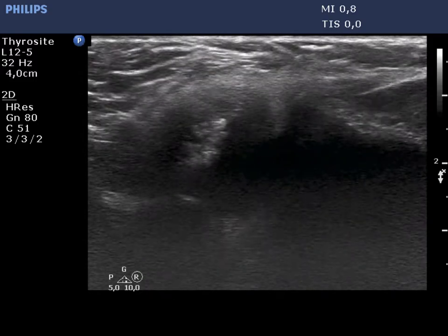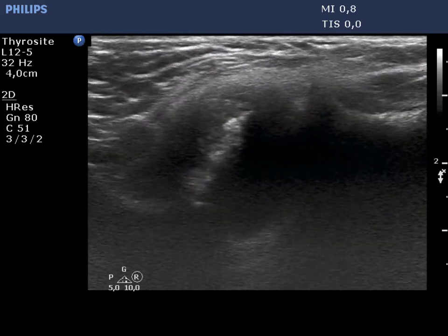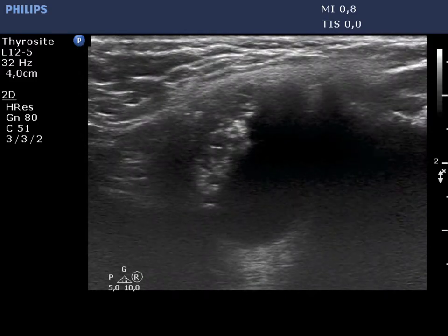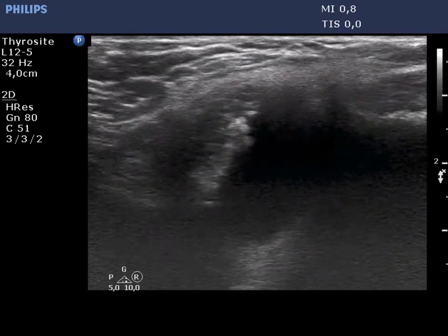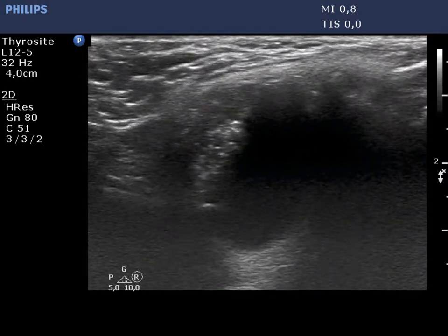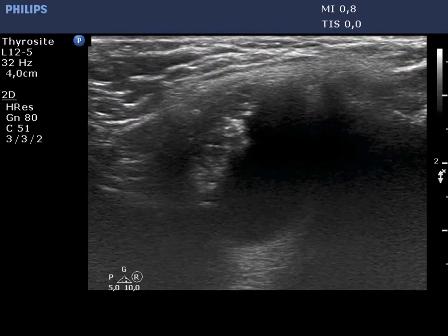Now, the mass on longitudinal scan. The solid part is hypoechoic and it is located in the upper pole of the lesion.